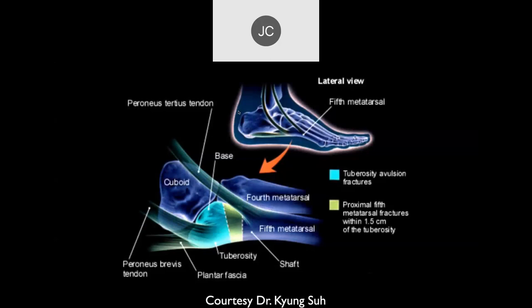Now let's talk about the base of the fifth metatarsal, which is a common area of injury. Classically, there are three types of fractures at the base of the fifth. One is an avulsion fracture, predominantly from traction from the peroneus brevis and plantar fascia attachment to the base of the fifth — really more the tip — which occurs at the tuberosity. Then there's a 'no-man's land' between the tuberosity and the diaphysis of the fifth metatarsal, with one and a half centimeters as the typical cutoff from the end of the bone toward the metaphysis.